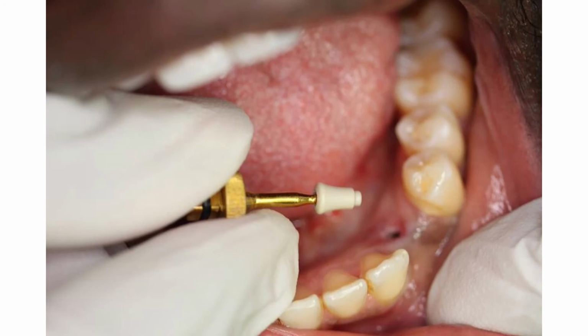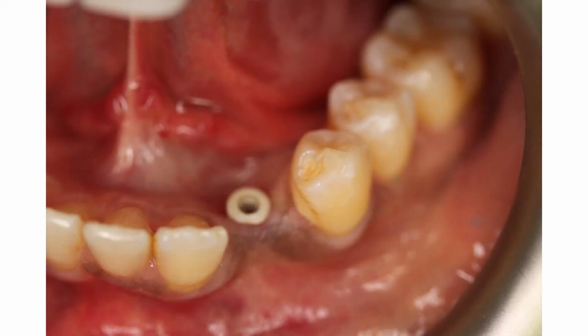And these fit on the end of your driver, and this is the same driver that's used for all the prosthetics in this system, and it's also the same driver that's used for the cover screw. So we only have one driver for the entire system when it comes to prosthetics, and that has been just pushed and placed into position and can be left there now, and the patient goes away.